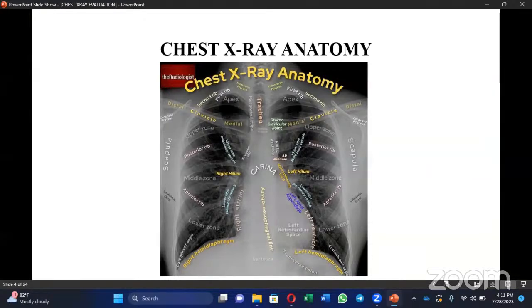And then let me pass this disclaimer. For the purpose of this session, we'll be dealing with the standard chest X-ray, which is the PA view, that is the posterior anterior view. We will come to that, but I just want to pass this disclaimer so that whenever we see an image on the screen that I've shared, it means that we are assessing the posterior anterior X-ray image. All right, I hope you've understood that.